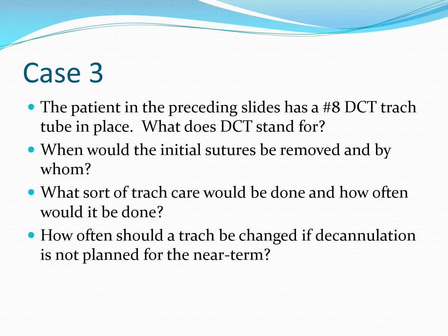Shiley uses these initials. When would the initial sutures be removed and by whom? Again, it would depend on a lot of variables, but typically no sooner than 2 to 3 days, as long as about 7 days. It's done in collaboration with the physician who's managing the patient. Often it's done in an ICU or a step down, and it's a very good idea to get an order, a formal communication from the physician that it's okay to remove those sutures.